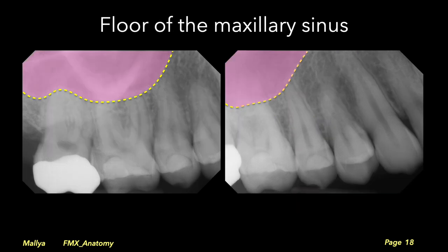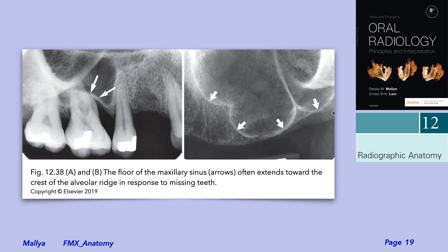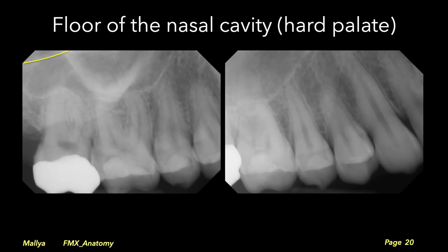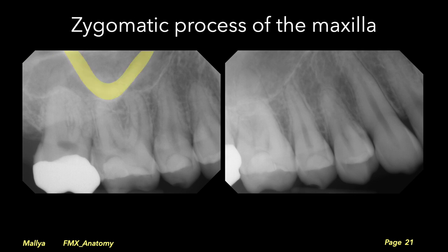Next evaluate the anatomic structures in this region, including the maxillary sinus. The maxillary sinus should be radiolucent, and its floor appears as a sharp white corticated line that is distinct and often undulating between the roots of the teeth. Evaluate for any thickening of the mucosa along the floor of the maxillary sinus, which may indicate sinus disease. Remember that in edentulous areas the sinus often pneumatizes the alveolar bone. Also visible is the hard palate and the zygomatic process of the maxilla, which appears as a radiopaque U-shaped structure that may be superimposed over the maxillary molars and can obscure details.